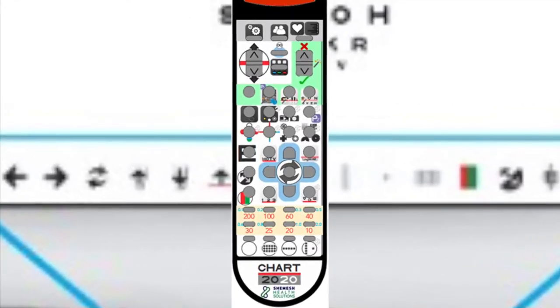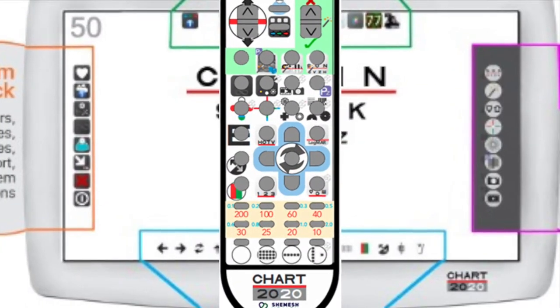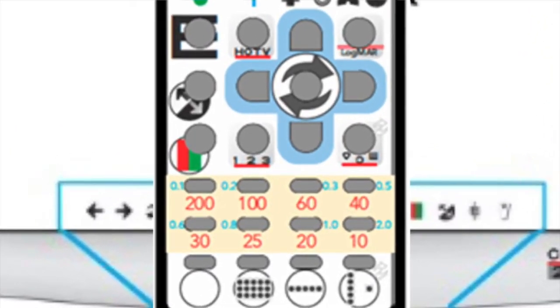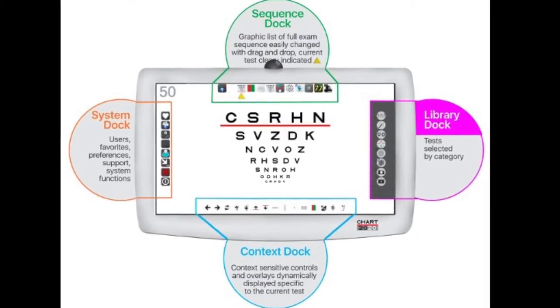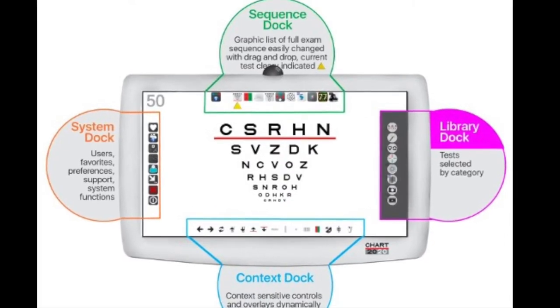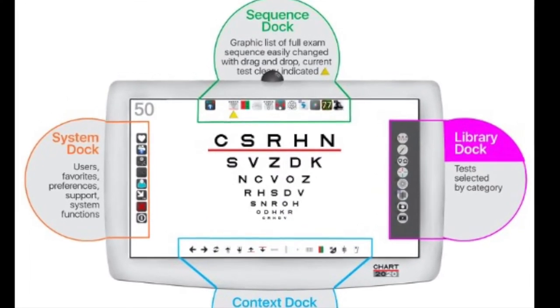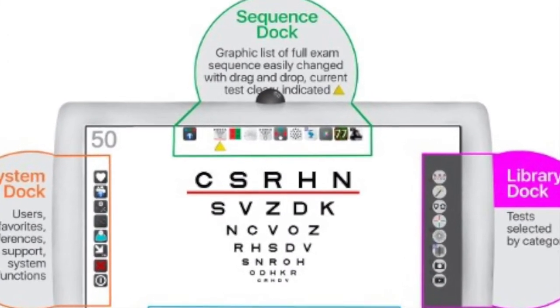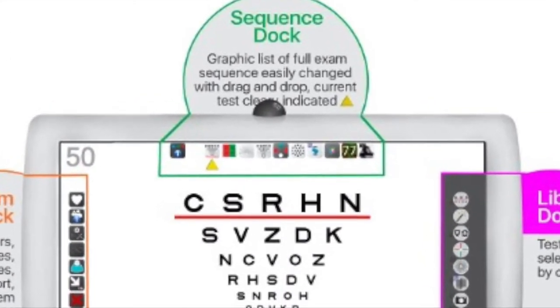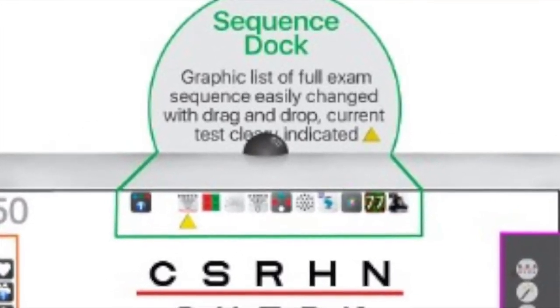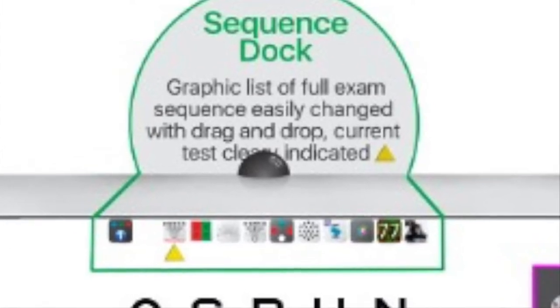The same icons displayed in the menus are used on the multi-button remote controller, so once your infrared remote controller arrives, you will instinctively recognize the buttons. The Sequence Dock is a fully editable dock in which a series of ordered tests commonly performed in a standard examination process are organized on demand and at any time by the user by simply dragging and dropping tests from the library onto any indicated position on the current sequence.